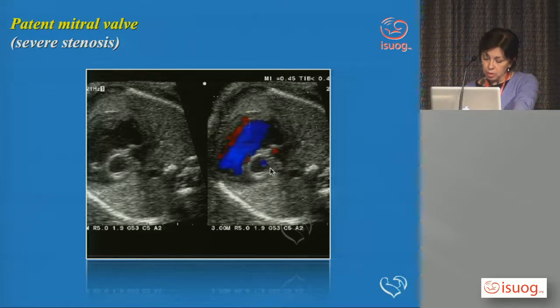We know the mitral valve is patent because you can just see a tiny little bit of flow here that managed to go through that patent valve, but insignificant compared to the tricuspid valve. Does it matter? Not really in terms of surgical procedure, but it does add risk factors because they are more likely to have coronary, left ventricle to coronary artery communication, fistulous communications, which may affect coronary perfusion, and if it does, it could then impair the function of the right ventricle, which is the only ventricle.